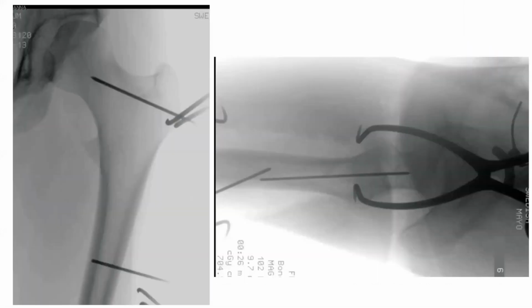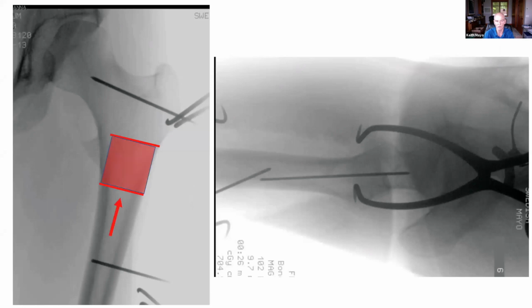We're going to go through this sequence again. So reference Kirschner wires. We're going to do an incomplete intertrochanteric osteotomy, a complete subtrochanteric osteotomy. We're going to do a bony resection, and then we're going to shorten this, essentially translate the diaphysis up, having measured the relative widths of the diaphysis relative to the metaphysis to make sure it's going to work.